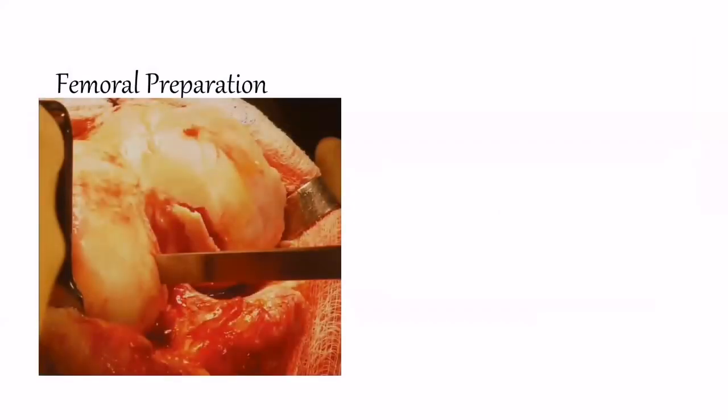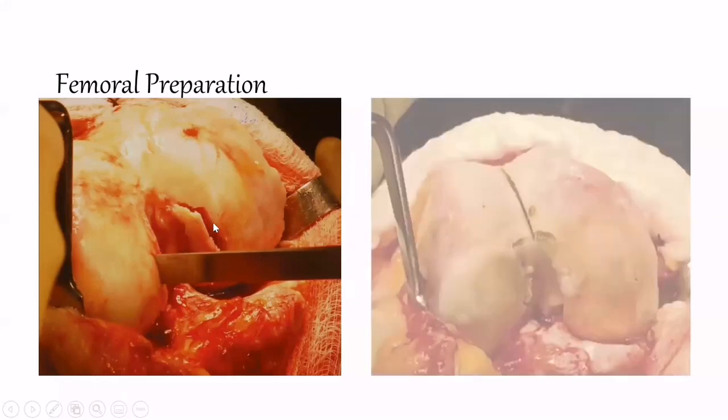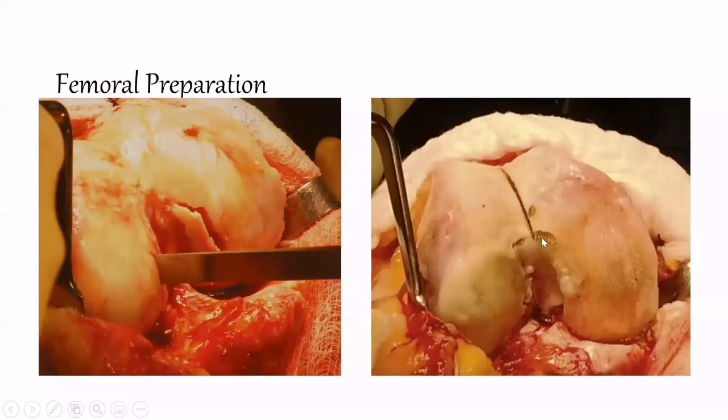As you see, after flexing the knee to 90 degrees, the femur can be prepared first, but how to prepare it? You have to remove, this is the picture of removal with a fine osteotome, the intercondylar notch osteophytes, some of the knee in severe osteoarthritis, you may see this area. You have to evacuate all the osteophytes in order to see the PCL, especially the origin of the PCL. So after that, you can draw the Whiteside line.